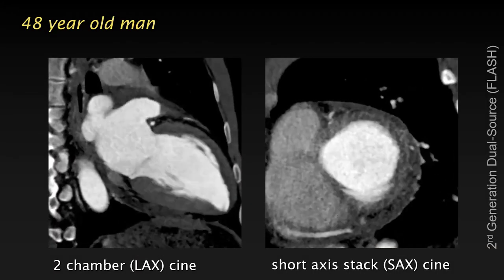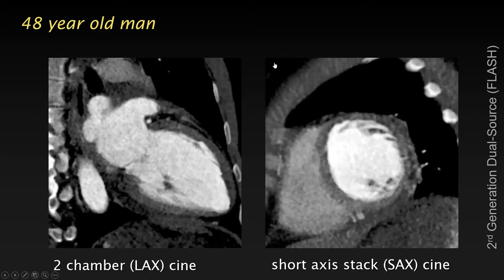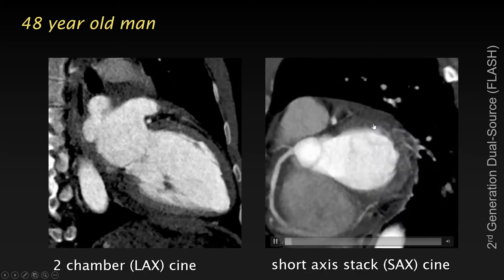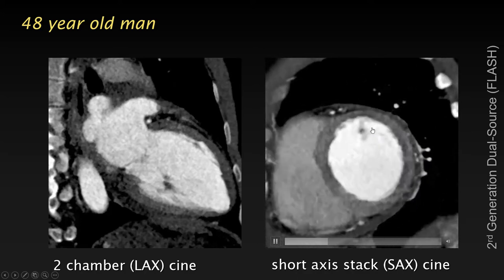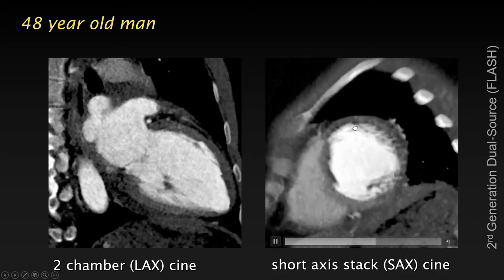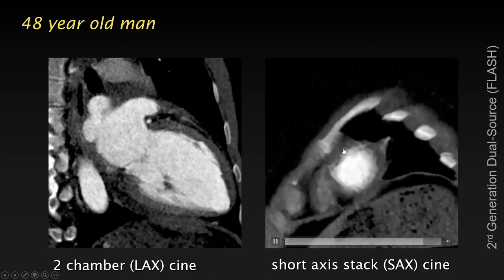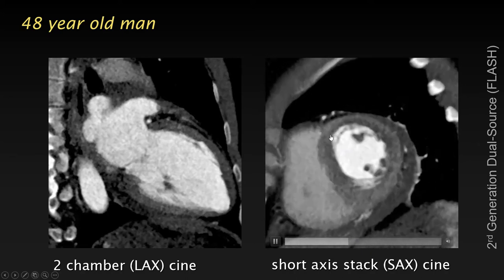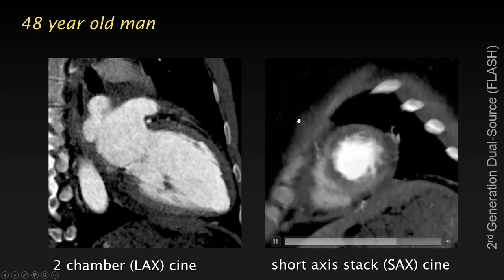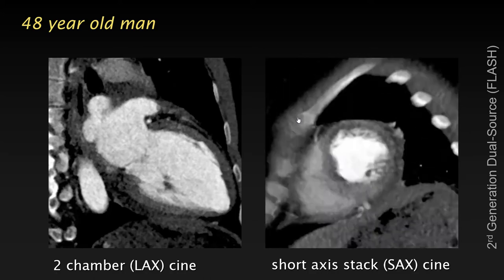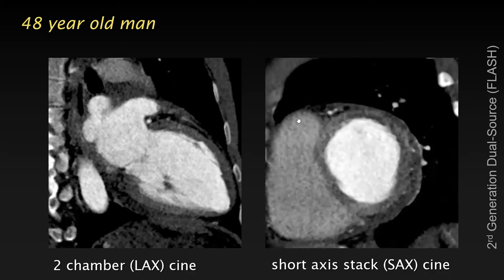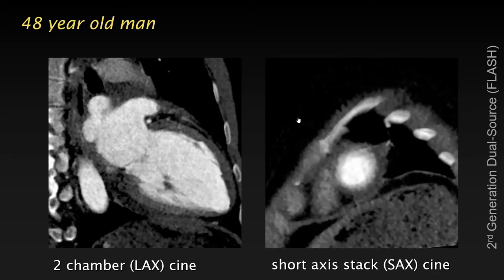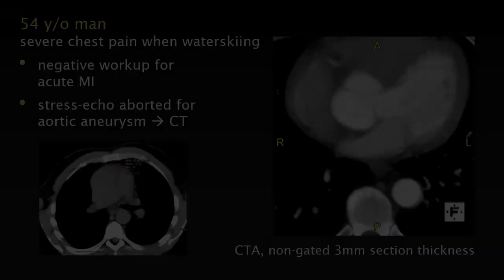Since we had a 4D-gated dataset, we also reconstructed cardiac images. On short-axis views, a portion of the myocardium doesn't contract — the wall doesn't thicken and doesn't come in, with a mild subendocardial zone of low attenuation due to severe underperfusion. This is severe ischemia caused by the dissection flap occluding the left main. Interestingly, after surgery the patient survived well and never developed a myocardial infarction — his troponin never rose — so it remained severe ischemia without infarction.